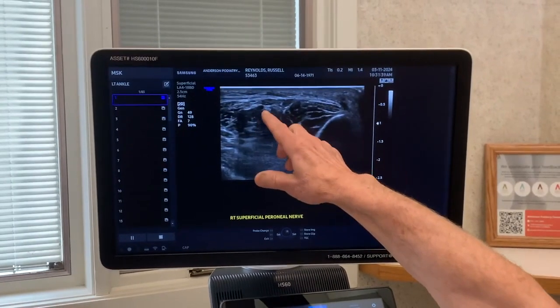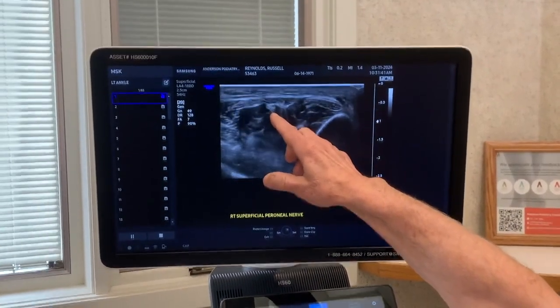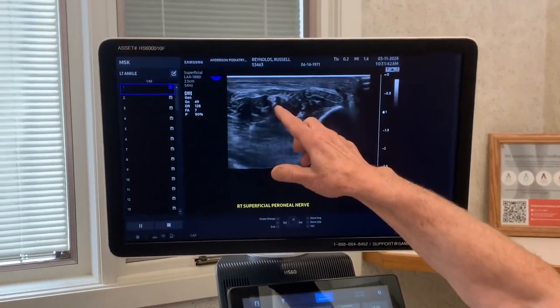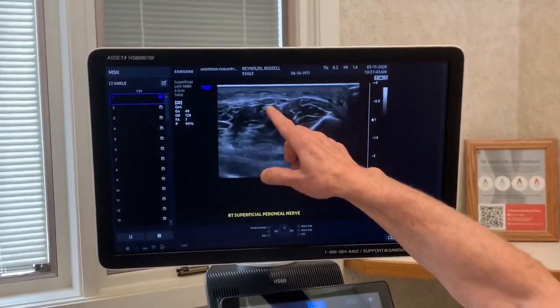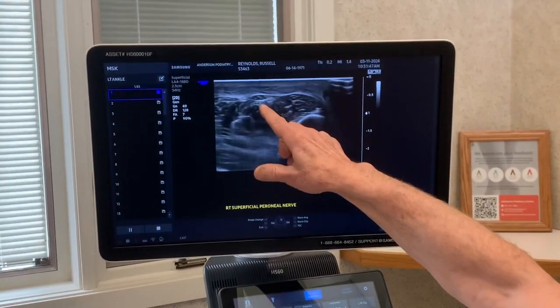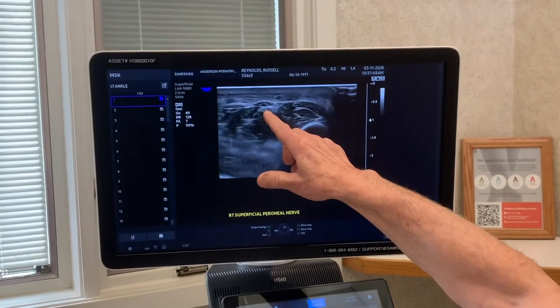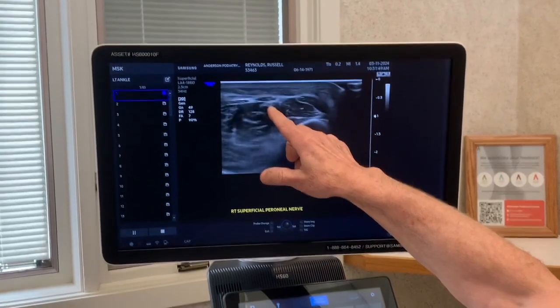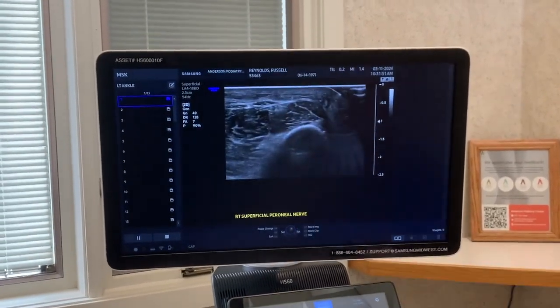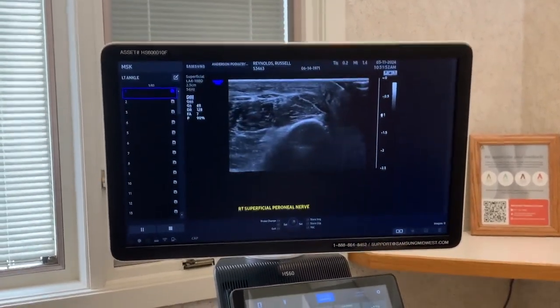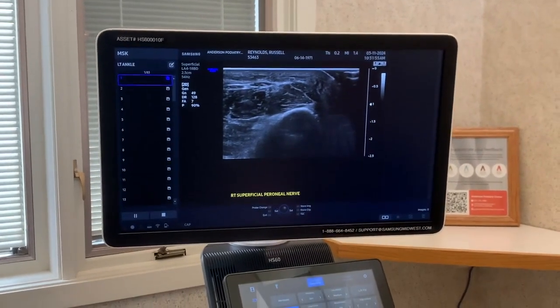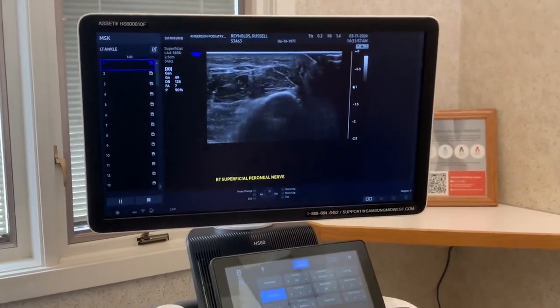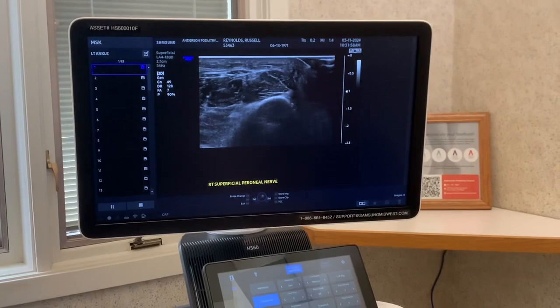Watch what happens as I scan down toward the ankle. High up in the leg, moving down toward the ankle — watch — that nerve becomes compressed, getting very flat. Around that area it's going to make its transition from underneath the fascia to the top. I think that's showing you physically that there is compression.